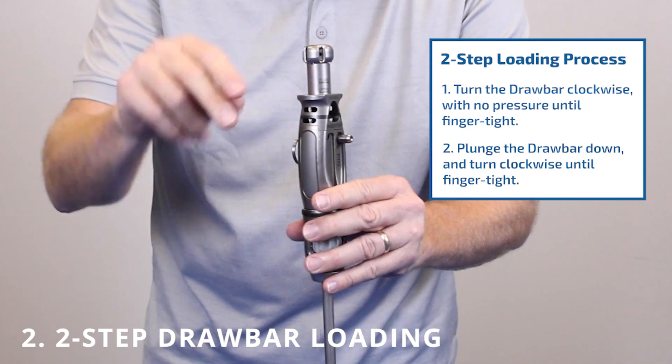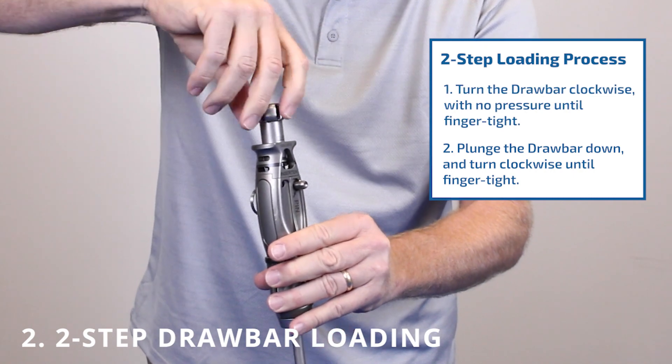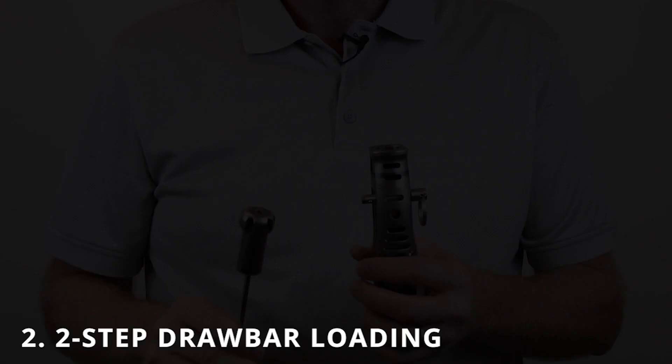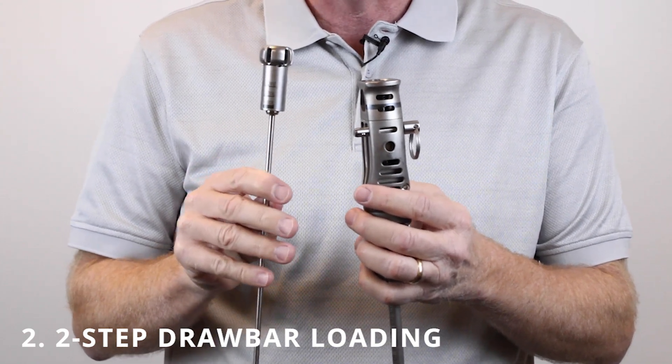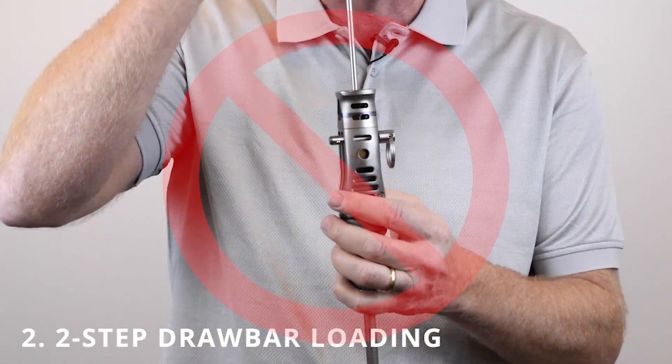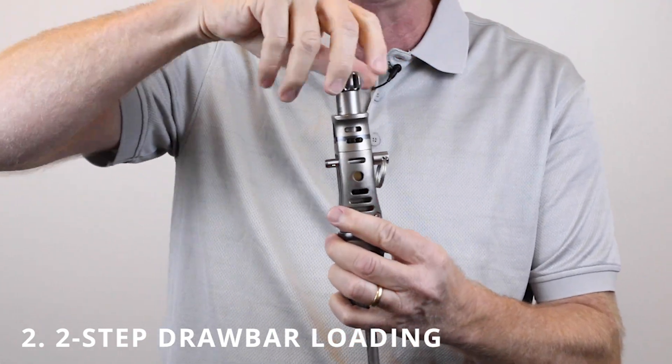The second step: plunge down on the drawbar and turn while plunging until it's tight. It is critical to load the drawbar in those two distinct steps. Do not just plunge the drawbar and screw it down — this will lead to an improper loading of the implant.